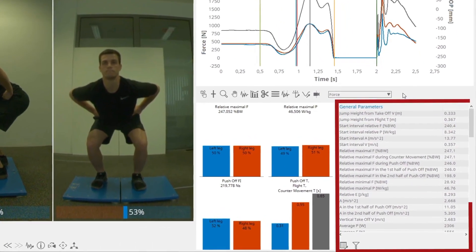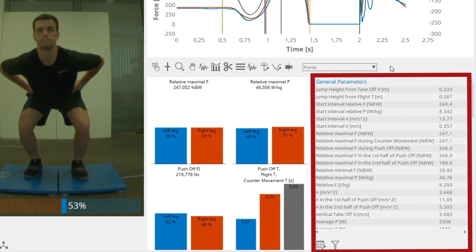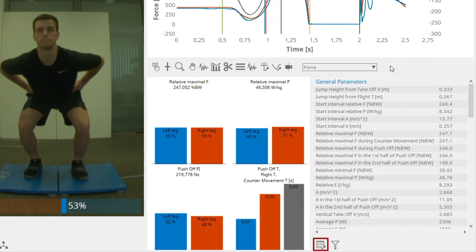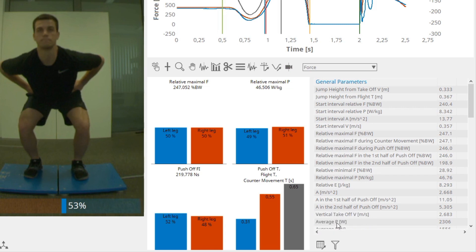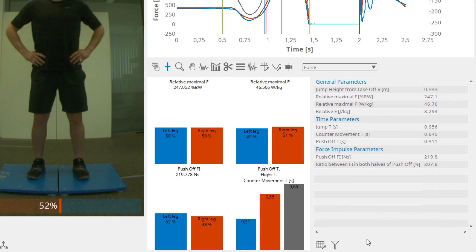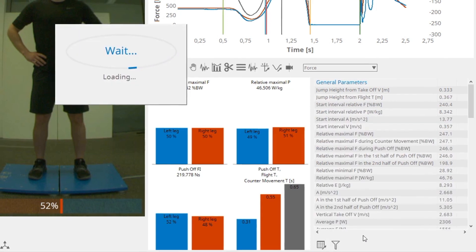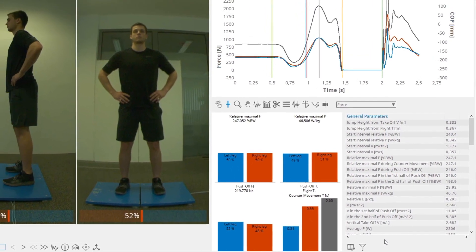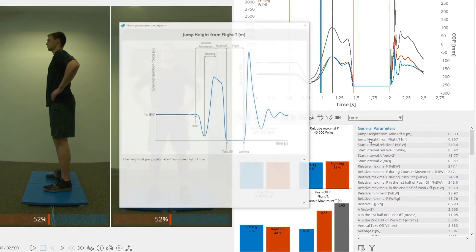The table contains all the calculated parameters, divided into different groups. The results from the table can be exported by clicking on the Export Table button. You can define which sets of data analysis parameters are displayed in the table. These options can be accessed by clicking on the Filter Visible Parameters button, where you can select between predefined parameter views or create your own by selecting Manage. A more detailed description of the parameters can be accessed by left-clicking on the parameter's name.